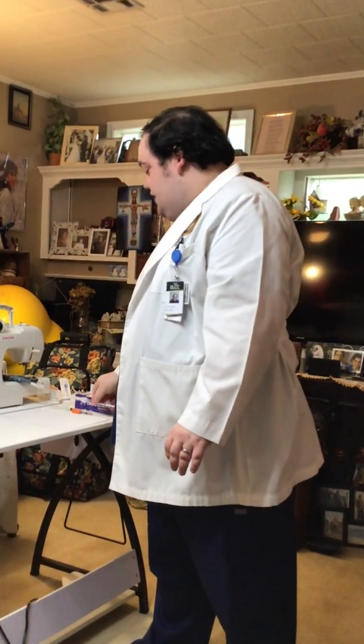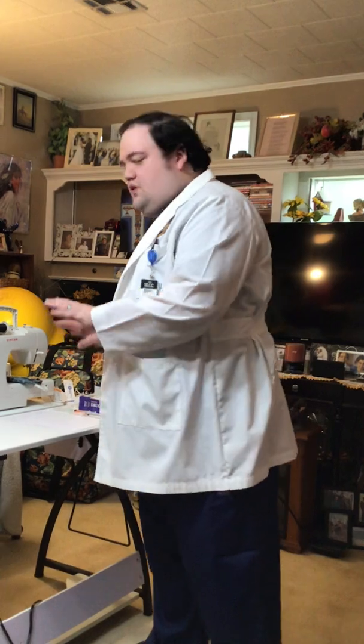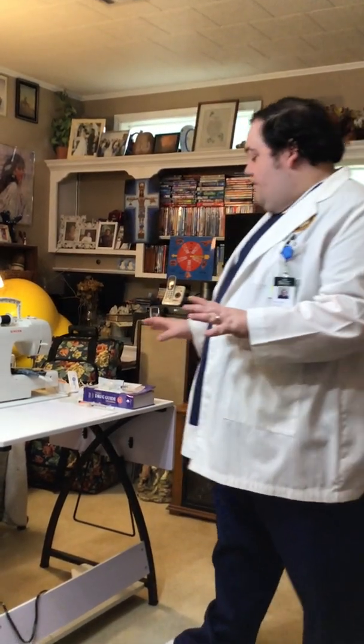intradermal shot. Now, this needle looks way bigger than what it is. Okay, we would not use a large size needle for an intradermal shot because we're barely going in. But it's not as big as it looks, so keep that in mind. All right, so we have our medication ready. We're going to take our vials.